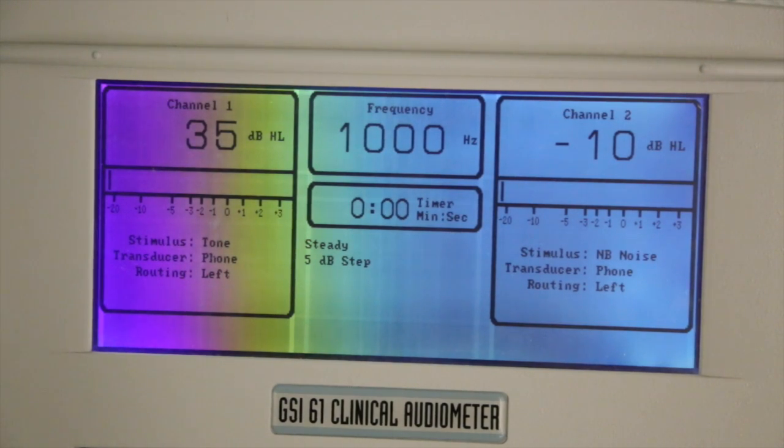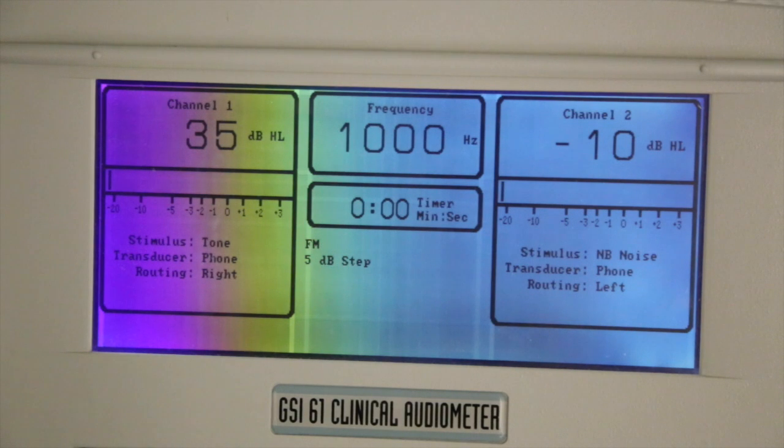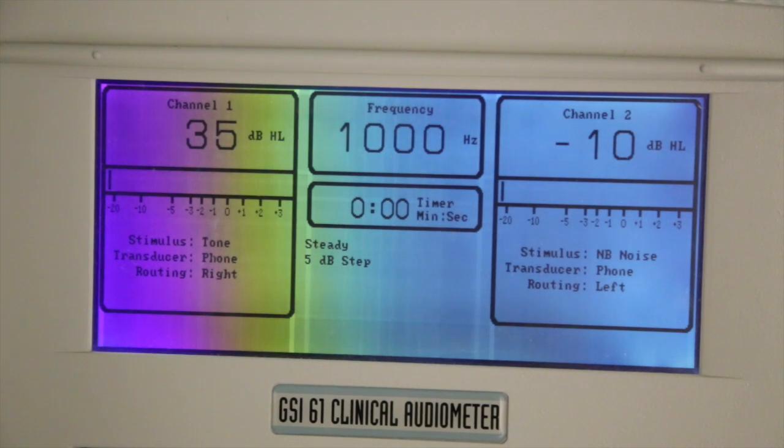When commencing a hearing screening, you would like to test the better ear or the right ear first. The test sound can either be a pure tone or a warble. The warble should be selected when testing children or clients with tinnitus. The length of presentation should be between 1 and 2 seconds. Start with a stimulus intensity of 30 decibels if hearing loss is not suspected, or 60 decibels if a hearing loss is suspected.